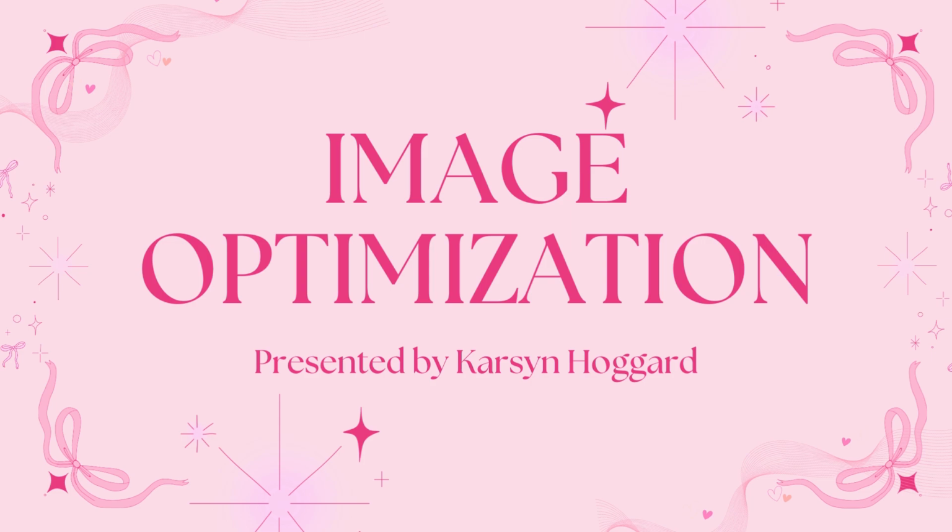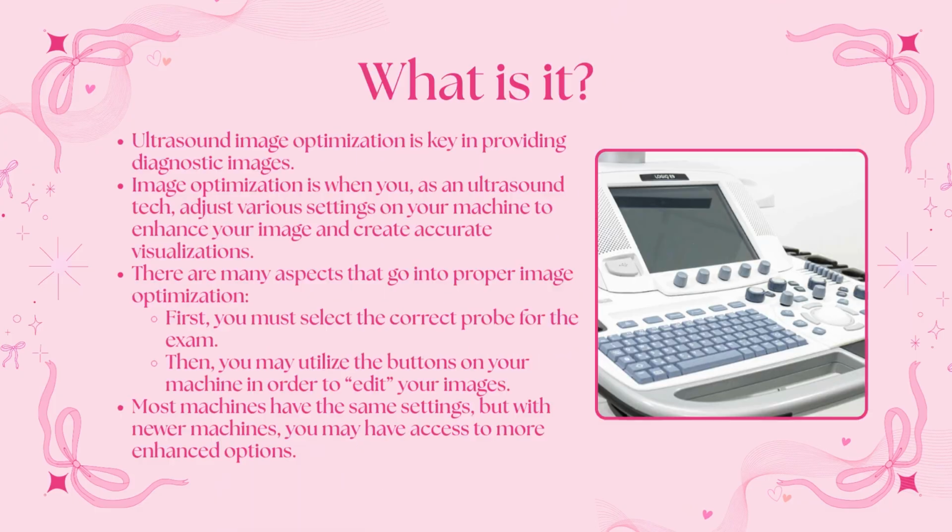I'm currently in the ultrasound program here at LCC, and today I'll be talking about how ultrasound physics is key in optimizing ultrasound images. So, what is image optimization? Ultrasound image optimization is key in providing diagnostic images. Image optimization is when you, as an ultrasound tech, adjust various settings on your machine to enhance your image and create accurate visualizations.